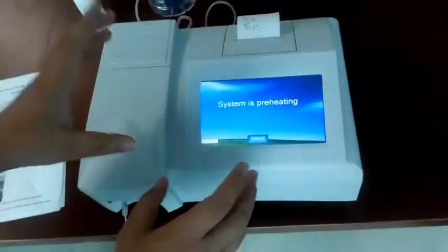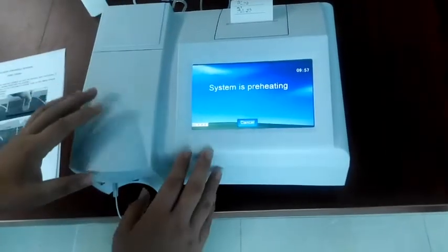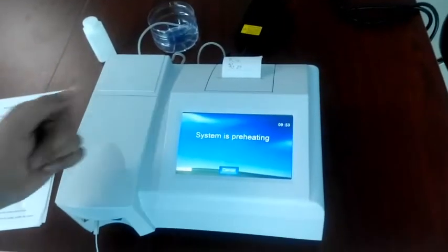After finishing this, we just turn on the power switch. Now you will see the interface. Usually it's better to wait 10 minutes because the system is preheating, but it's also okay to work now.